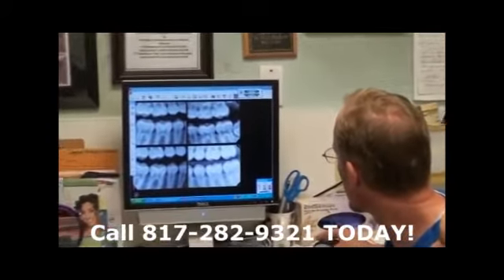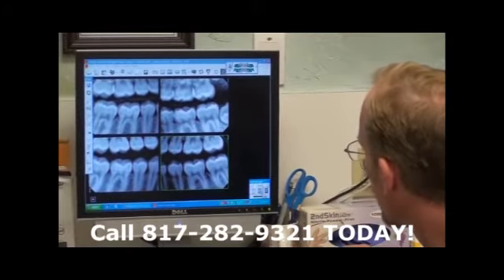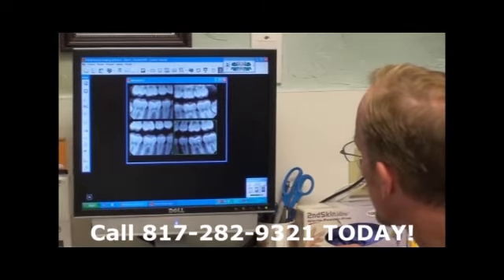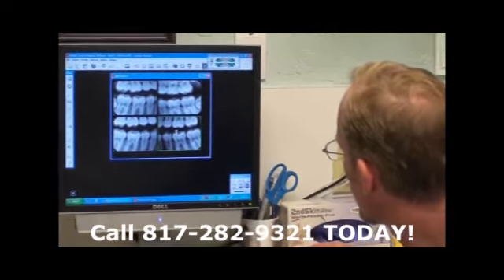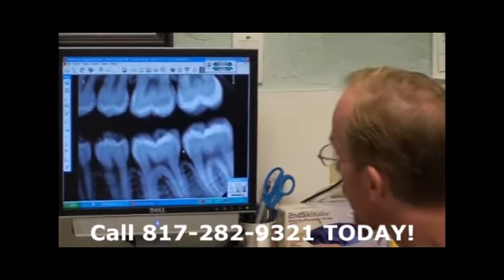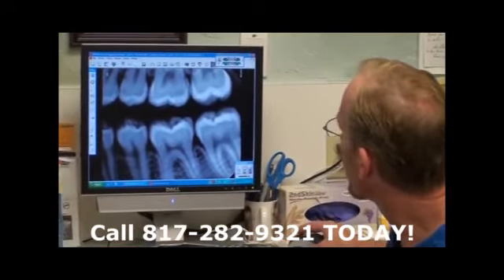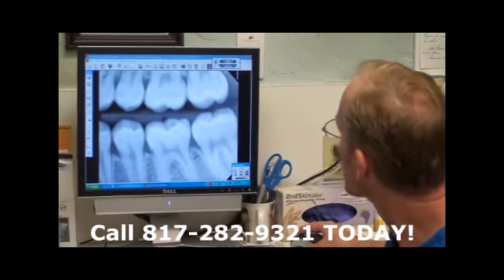So, for example, I can change the image to be darker or lighter, and if I need to look at it closer, I can make the image much larger and blow it up to that size. By enhancing the image, it allows me to look for areas on her teeth where she may have some cavities.